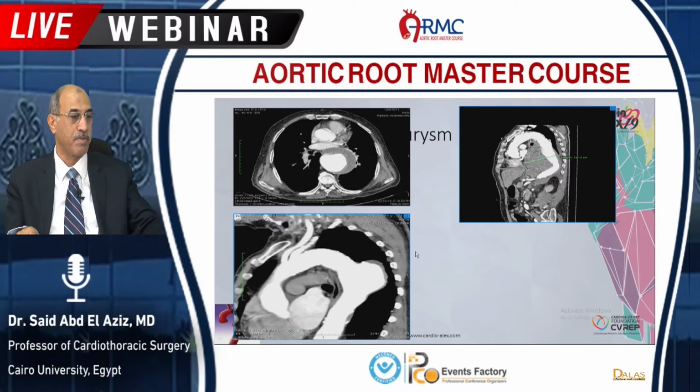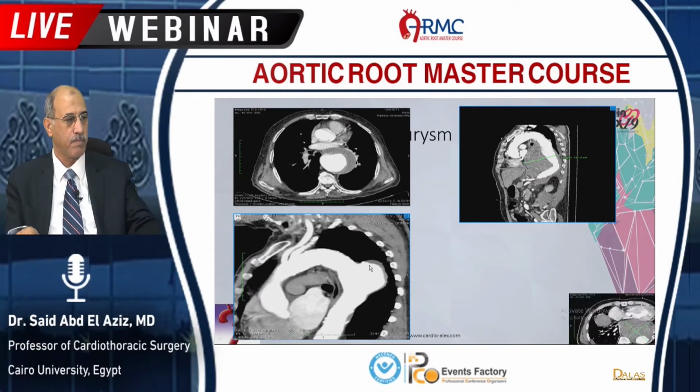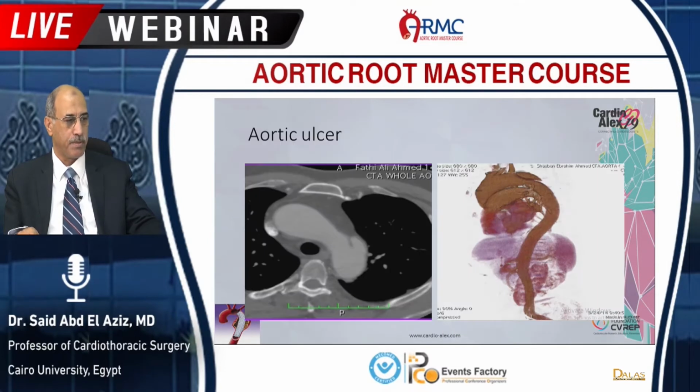This is another one, but this is a localized aneurysm. We cannot call this a penetrating ulcer because this is a true aneurysm. And this is another one. Here we can call this an aortic ulcer, like I presented in the first presentation. It is one of the indications of TEVAR in the treatment of descending thoracic aortic diseases. This is a penetrating aortic ulcer in the descending aorta. We call it penetrating aortic ulcer type B.